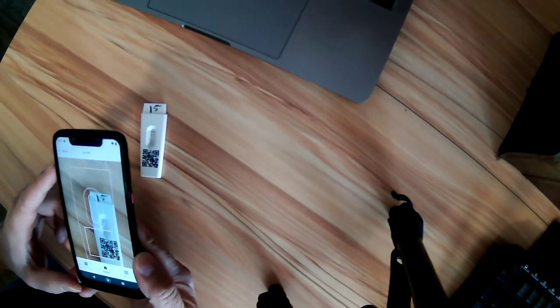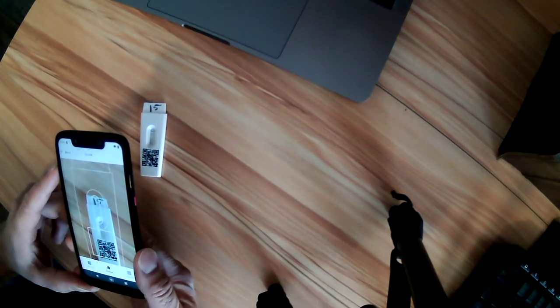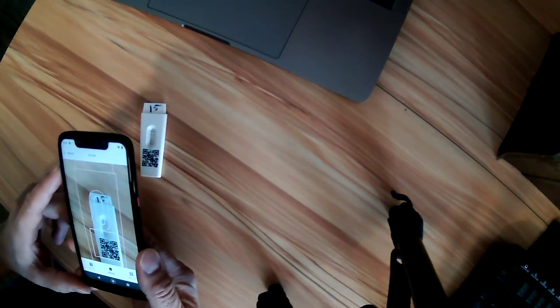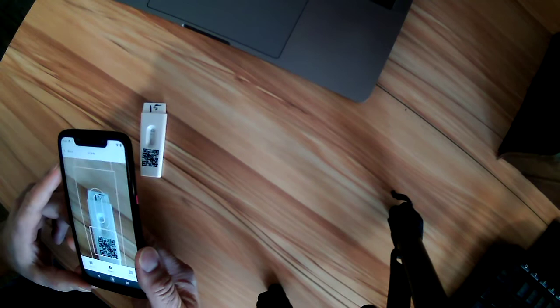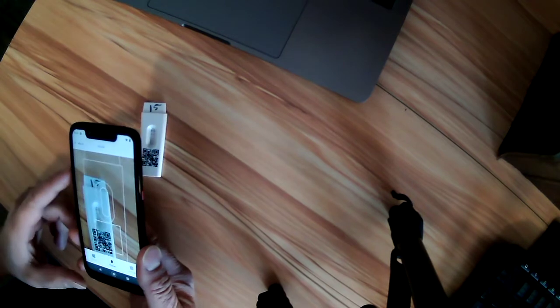You'll also notice that if there's bad lighting, so if the room is dark or it's lit by lighting of a weird color, if you have like a UV light in the room or something, it might ask you to move to a different location. You'll see a little banner pop up guiding you to go somewhere else.